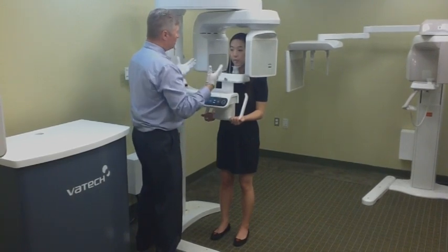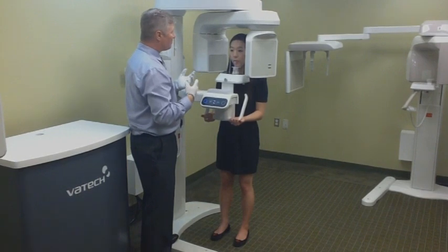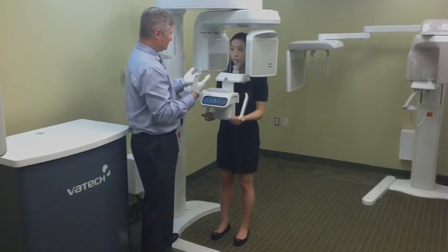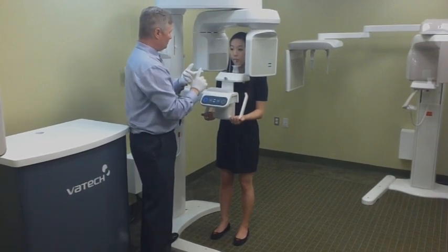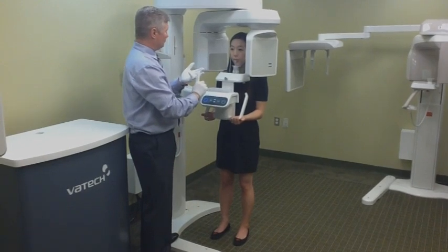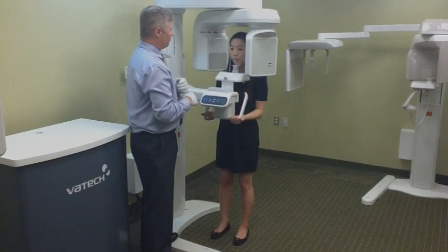Okay? So at this point in time, what I'm going to do here is set the computer up to capture our image. When we're done with that, I'm going to then provide you with the following instructions. Okay? I'll need you to go ahead and close your eyes for me. Okay? I need you to go ahead and swallow. Place your entire tongue in the roof of your mouth. Wrap your lips around the bite block like you're sucking on a straw, and then count to 30 for me. And that's it.